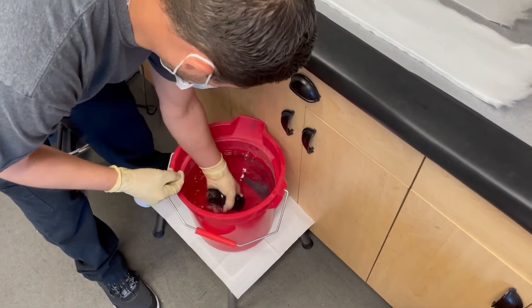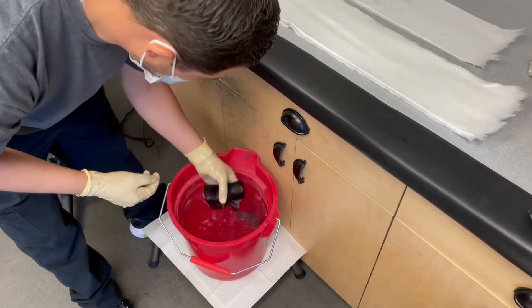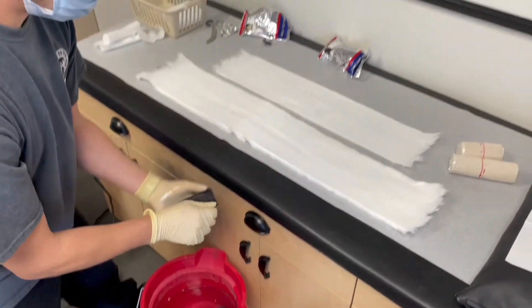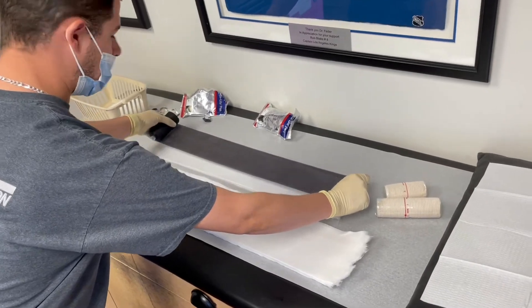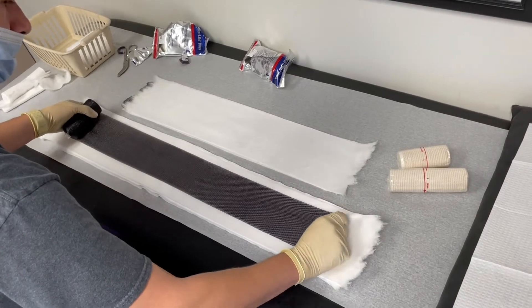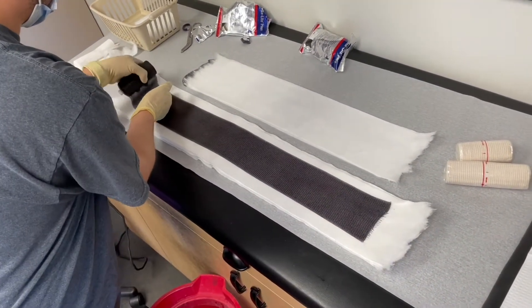We'll dunk the fiberglass in the cool water once, squeeze out the water, and lightly shake the water off of the fiberglass. We conveniently already have the length of the fiberglass splint measured out from before, so we'll go ahead and place it down on the larger padding.